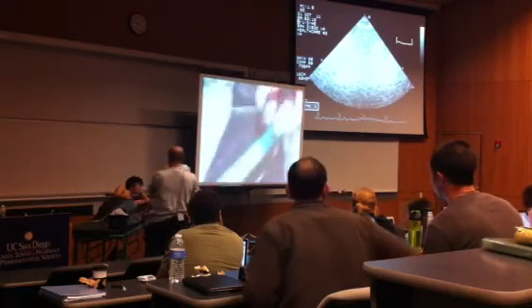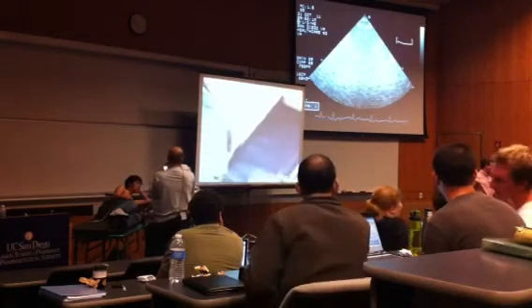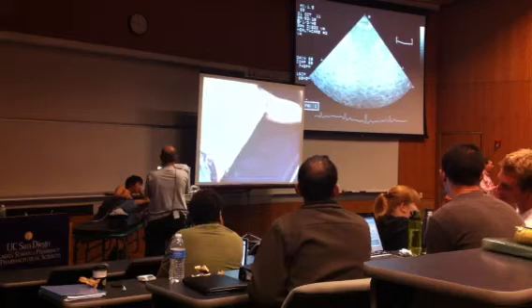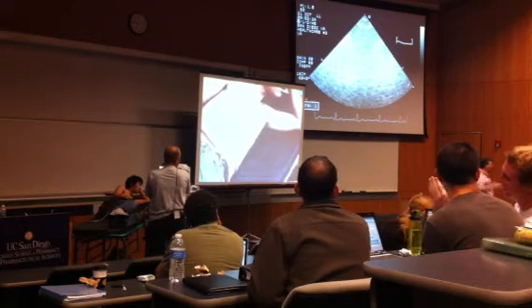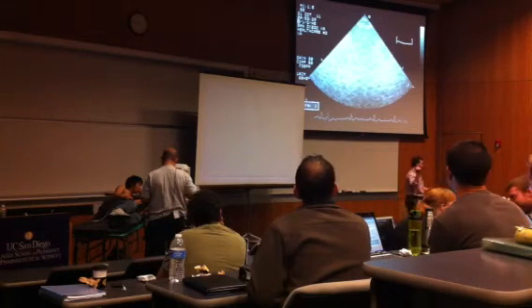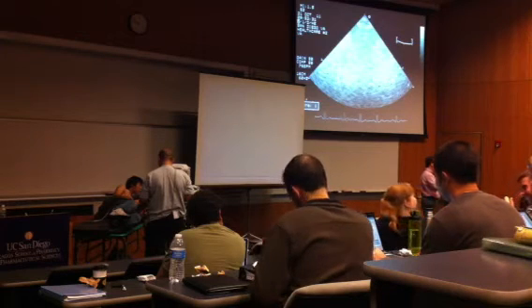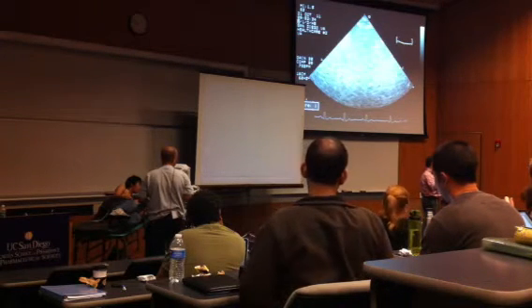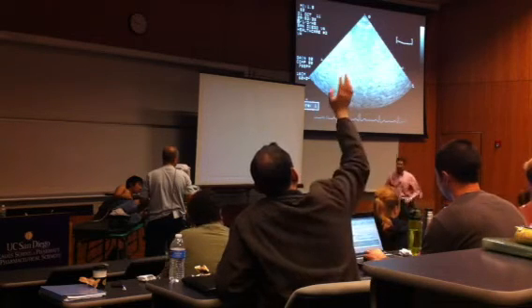Also, the depth from the chest wall in one of our subjects here is different than a mouse, and this person is different than many of the patients we have in the VA hospital that might have larger chests. So we can change the frequency dynamically on the machine with a dial. But at any one time, I think most of it is being sent out. There are multiple crystal arrays, the phased array crystal that sends out multiple beams at the same time.